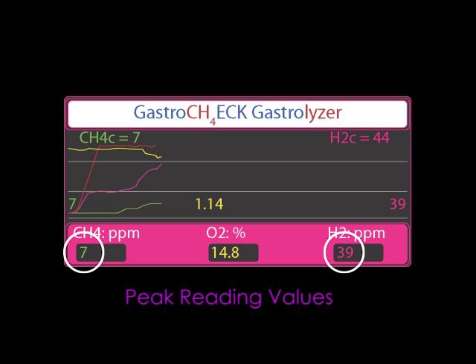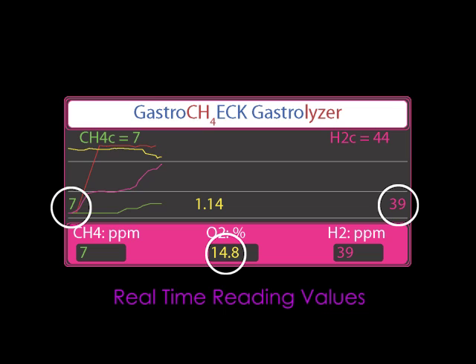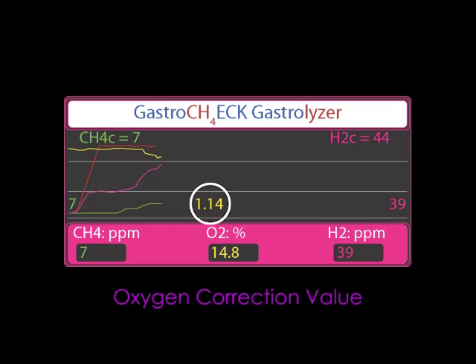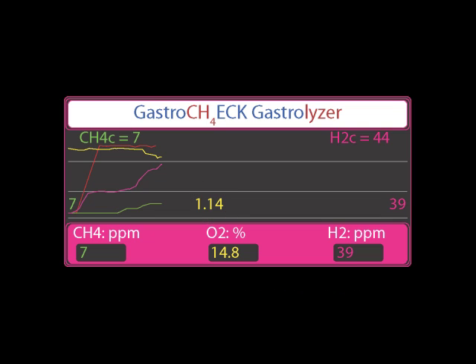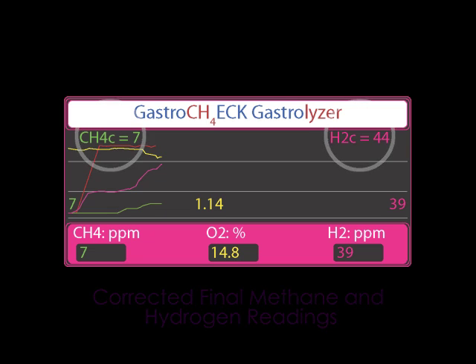These two values are the peak reading values for methane and hydrogen. These three values are the real-time reading values. The middle oxygen value is the oxygen correction value. And the two most important values are the corrected final methane and hydrogen readings.